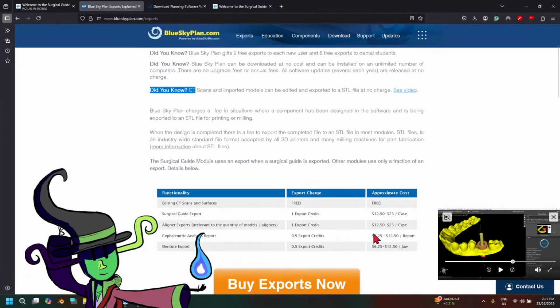Which I guess it's now fair to mention how dental CAD software charges users for their services. The dental CAD software community is just as bad as every other 3D modeling software out there, like 3ds Max or anything under Autodesk technically, where they will charge you an exponential amount of money to use their software.